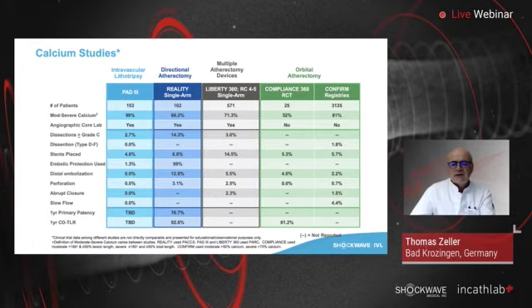And regarding embolism, we found no distal embolization. However, with, of course, any kind of atherectomy system, there's a given risk of distal embolization, which we didn't find with IVL, and the same holds true for perforations. So overall, even if this is not a one-to-one or direct comparison against atherectomy, IVL performs very well as compared to what is published for calcified lesions regarding the use of atherectomy.